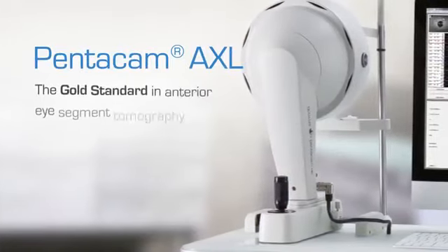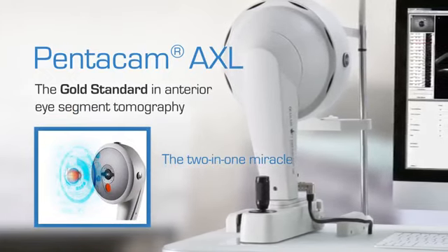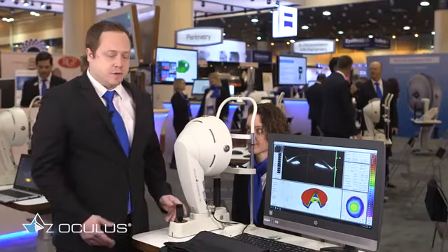I'm here to talk about the Pentacam AXL. Pentacam AXL is the newest model of Pentacam from Oculus, and it's the only device in the US that combines Scheimpflug technology with optical biometry. I'll start by demonstrating the ease of use of the device.